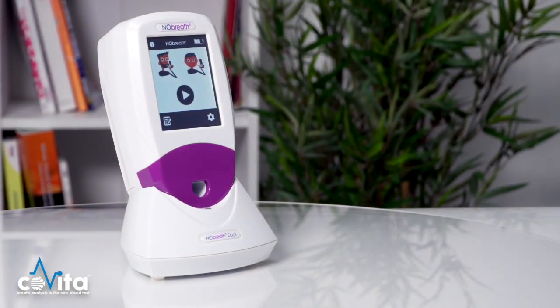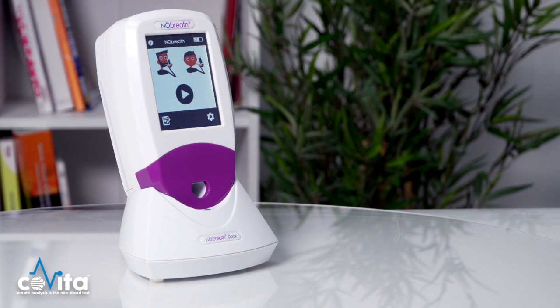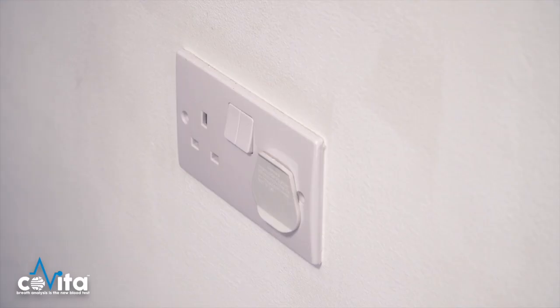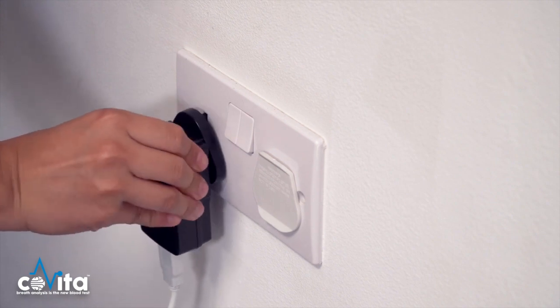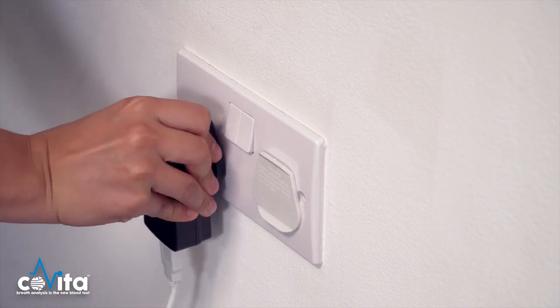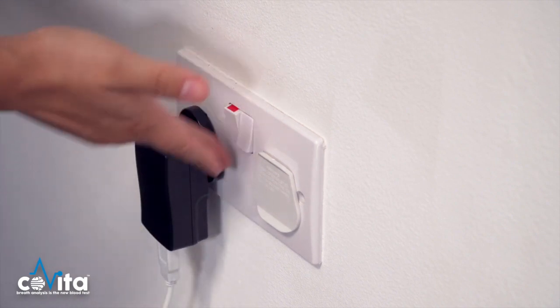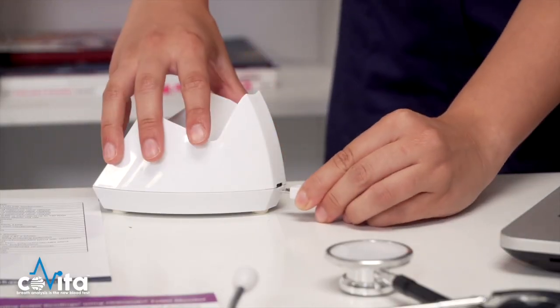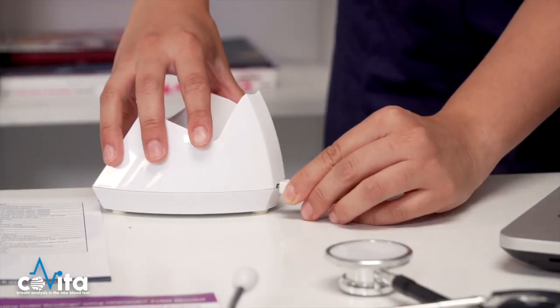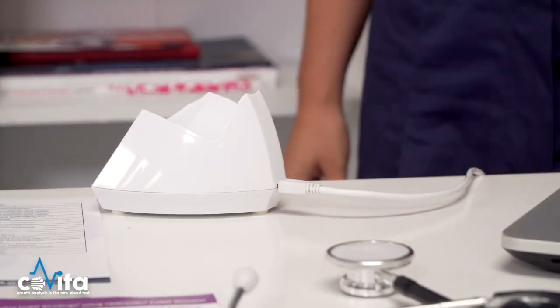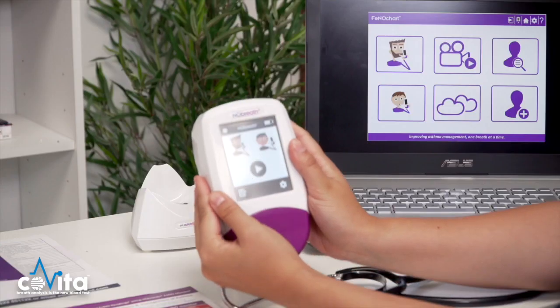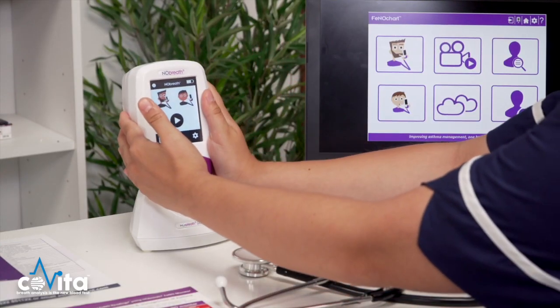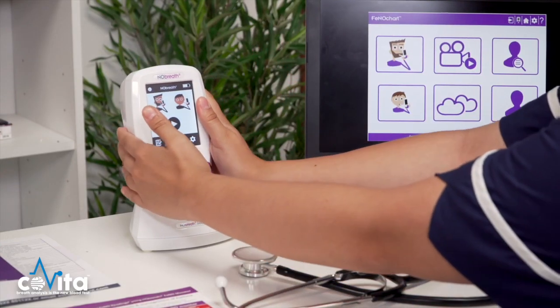The NOBRETH FeNO monitor comes with a dock and charging cable to keep your monitor at hand and fully charged. To charge the NOBRETH, first make sure that the docking station is connected to the mains using the charging cable provided. When it is receiving power, the green LED will light up and you may place your NOBRETH in the dock to charge it.